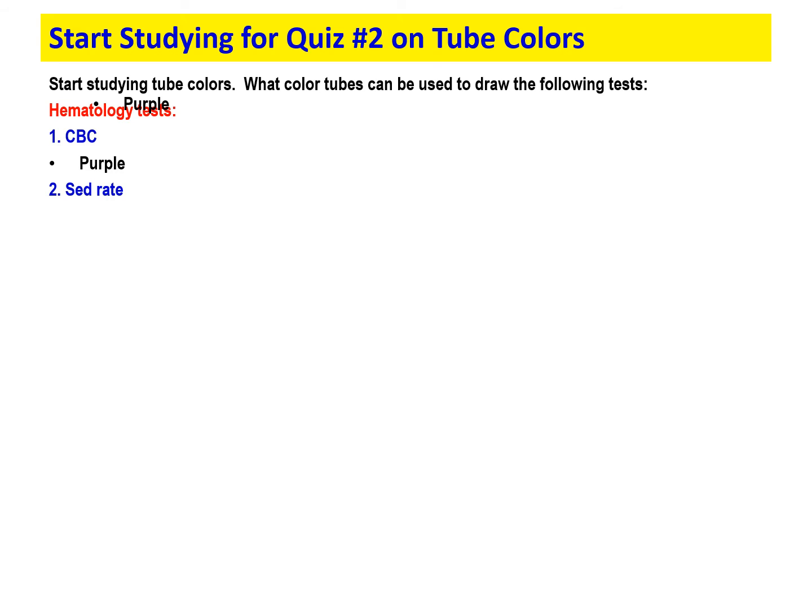What about a sed rate? Pause this here and see if you get the right answer. As we go through, make sure you're pausing each one of these tests as they pop on the screen to see if you are getting the right answer. Purple.